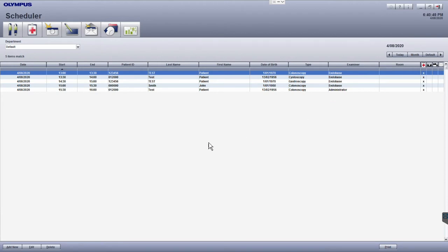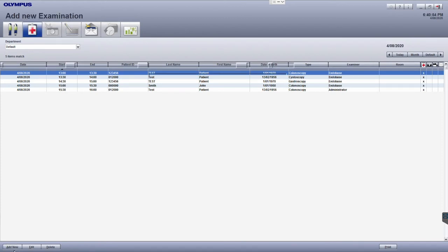To begin adding examinations to your list, click the Add New button in the bottom left. This will bring up the Add New Examination window.